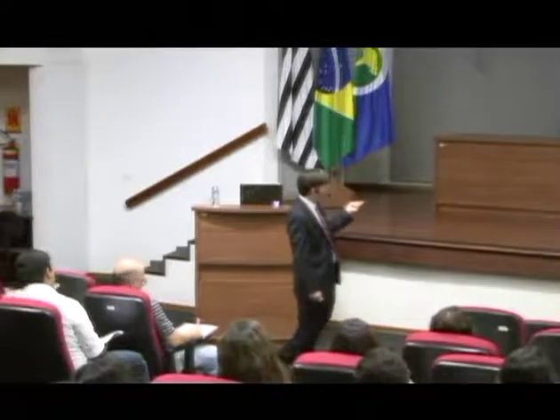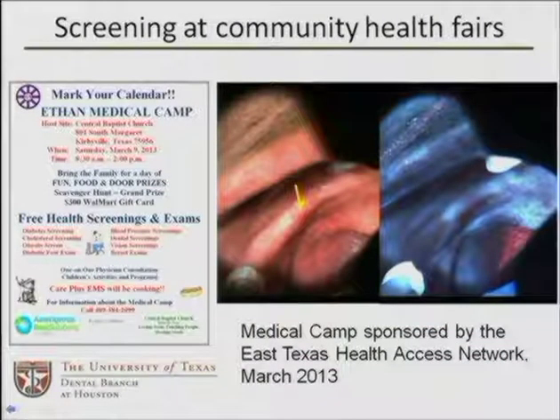These are images from one particular patient who was screened, who was identified by the clinician as having a lesion that was quite suspicious, that needed to have some attention, that the patient needed to come in for a biopsy and further evaluation. It was interesting to be there and see how this played out. First of all, the clinician's clinical diagnosis was based on a number of factors, not just the autofluorescence imaging, but also things like the patient's self-reported history and the location of the lesion and so on. But the autofluorescence imaging certainly did show a small region here that was of concern, and that was part of the reason for the diagnosis.